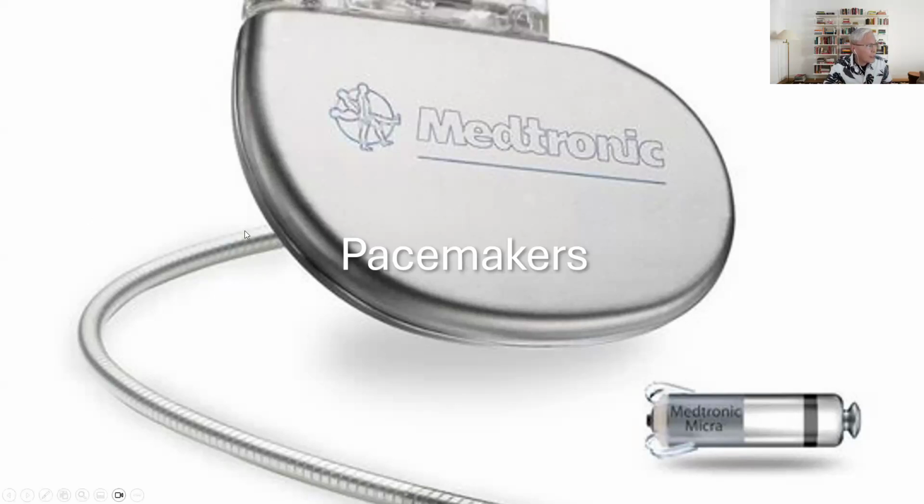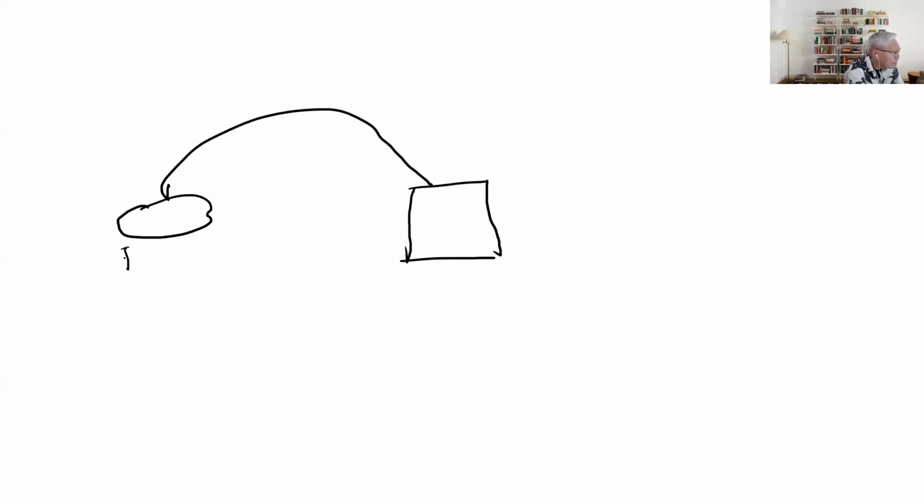And then there's a wire that now leads into the heart. There are several types of pacemakers, and they're basically going to be something like this. Before we go to the types of pacemakers, let's say that this is the heart, and this is a wire that is connected to your pacemaker. Now, there are two parts of this cable that goes into the heart. One is going to deliver the electrical current. So this one is the pacing electrode.